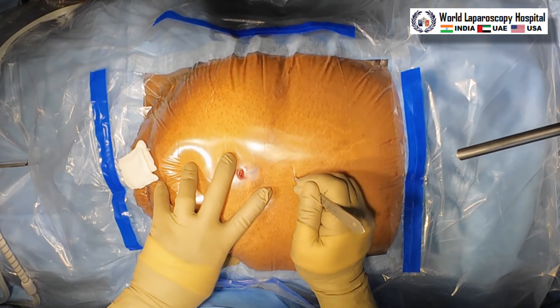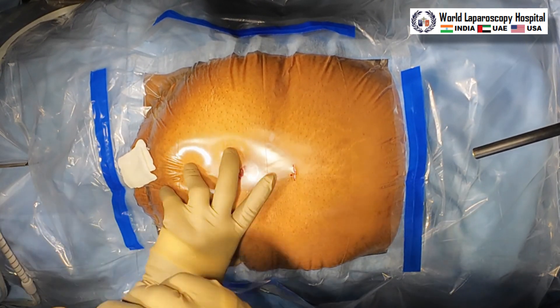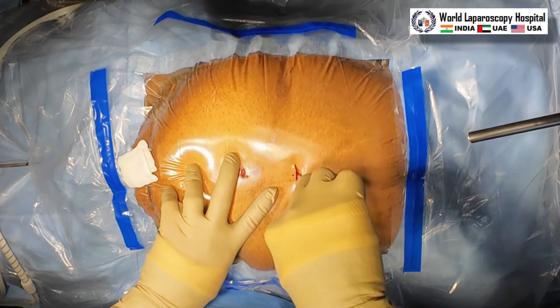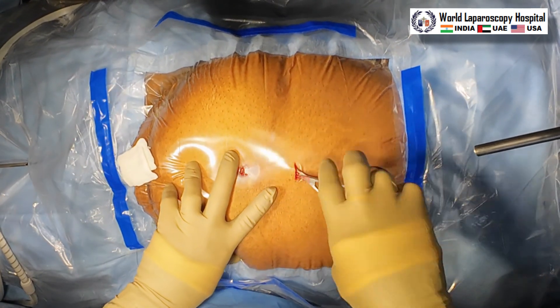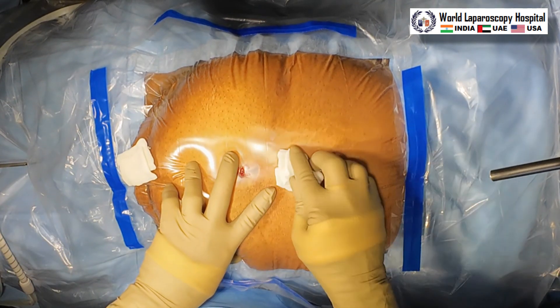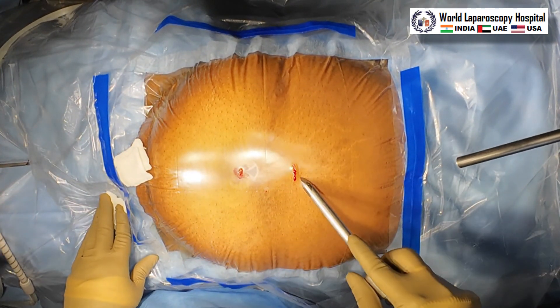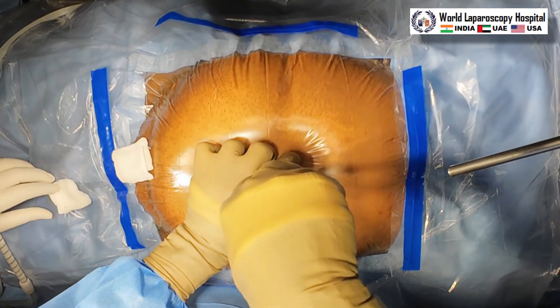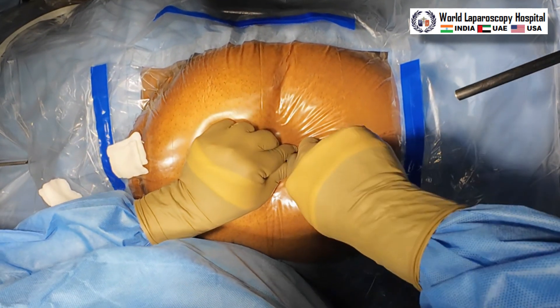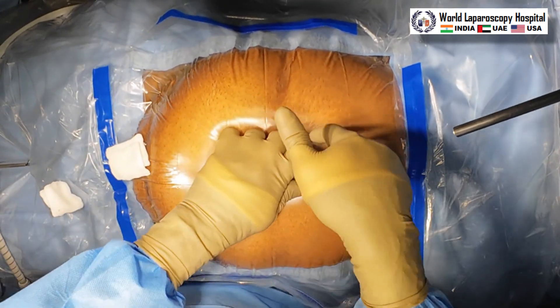The advantage is that you can have freedom of cranial traction — you can bring the cyst from the pelvis into the abdomen and will have more room to perform surgery. You can have a better panoramic view. That's why for most operative surgery, a supraumbilical port is preferred. This is the 10 mm port introduced supraumbilically, and after that we will put the telescope inside the abdomen.